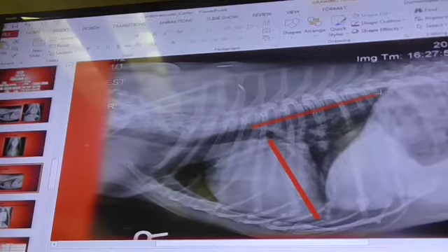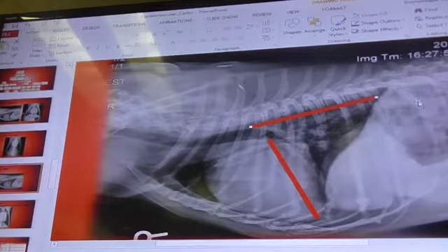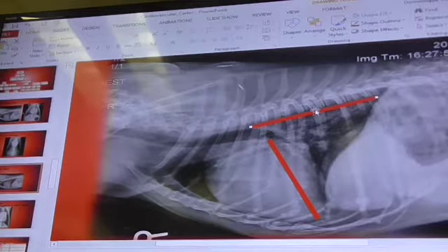Does this dog have 2 microchips? It probably does. A lot of times these babies will get microchipped twice, not realizing maybe the scanner at that hospital didn't pick it up, or it faded out, or they didn't take enough time to find it. So sometimes you'll see that they have 2 microchips.